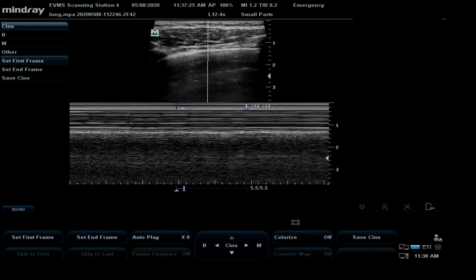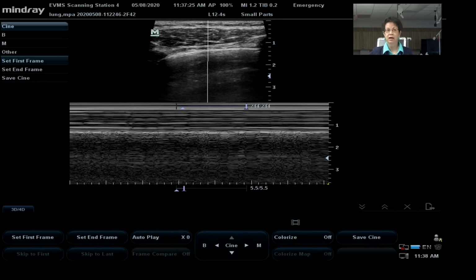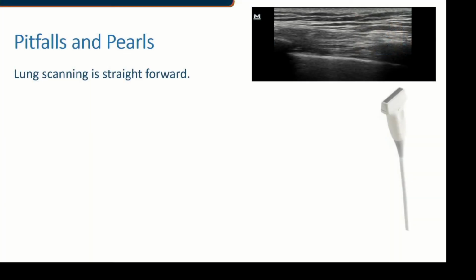ultrasound of the lung, just staying to our zone 1 and concentrating on pneumothorax. As you move through the program and begin to apply the other concepts to edema, and you've already encountered how you would find pleural effusion on abdomen, you'll be able to make even more assessments using lung ultrasound. Now let's talk about some pearls and pitfalls when we are doing lung ultrasound.